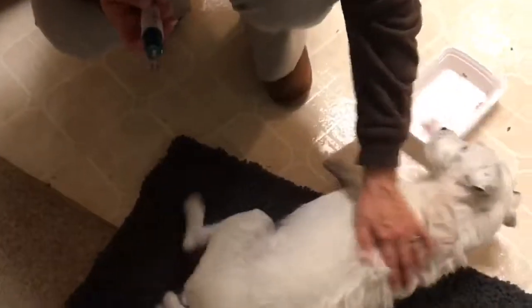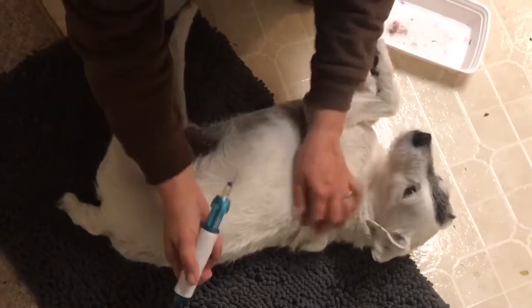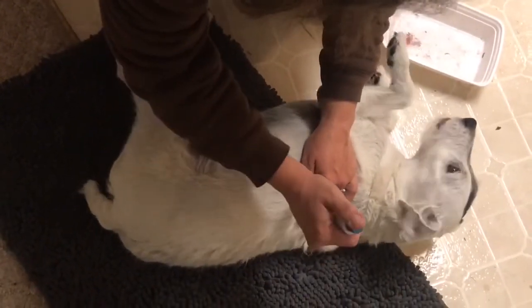Okay, then we come over. He's ready for his dose. He rolls right over. He'll give me a little funny snap just to keep me on my toes. And we're done. Super awesome. Thank you.